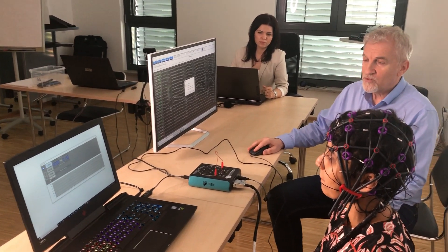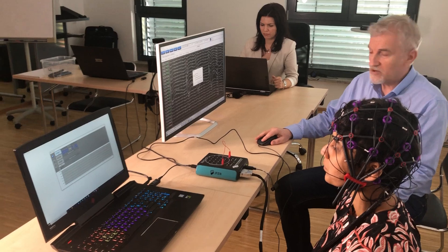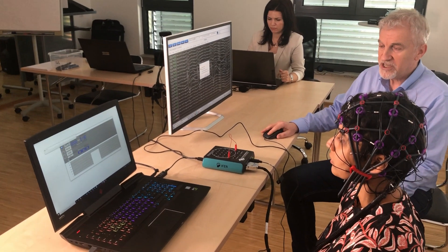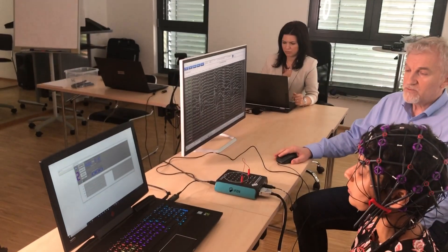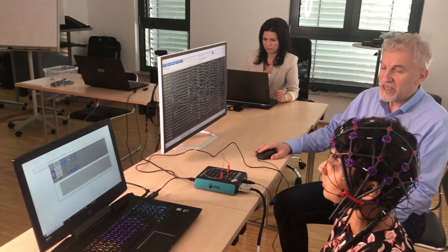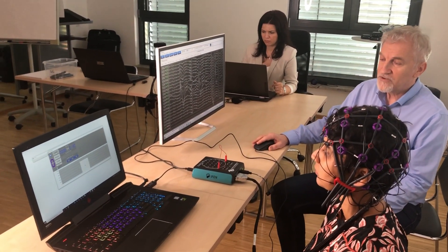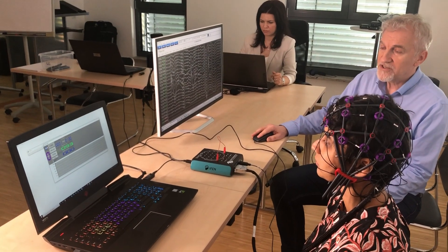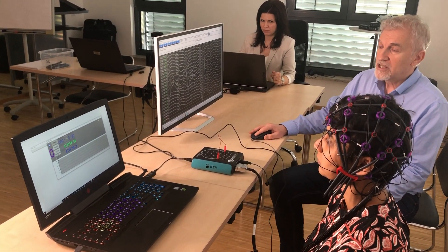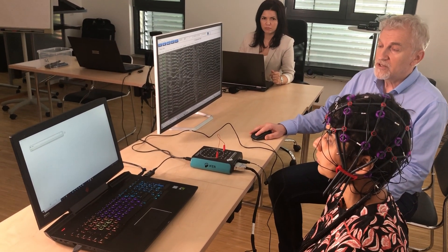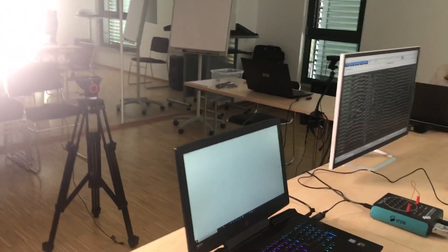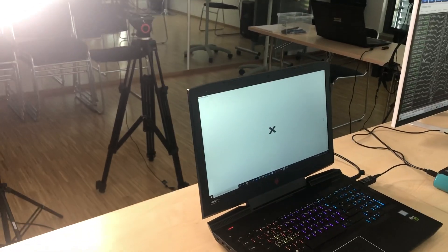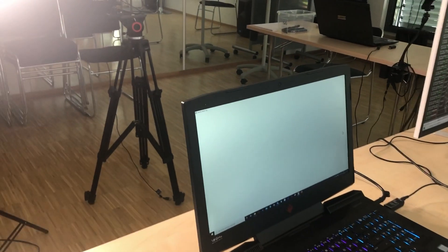Alright, so we're starting here, and we see that there is a countdown. Now it starts, and we make sure that the stimulus is presented well.